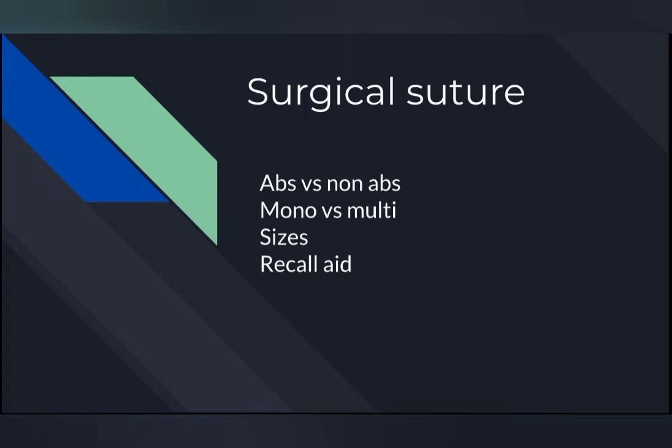Let's think of this from a common, logical point of view. If something is just a thread, it's very easy to tear or break it. So monofilament is one thread, but it is very easy to break. Now let's look at the other one, multifilament, many filaments together. It's surely going to be very, very hard to tear that apart. So that is a very simple way of understanding the difference in the classification.